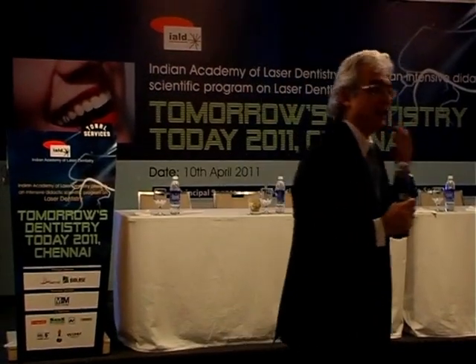And the same thing happens with a carious dentine. It absorbs the particular wavelength of the Diagnodent, and it emits it in a different wavelength, and then it beeps if there is a carious dentine. We know that there's 85% accuracy with the Diagnodent, with all the papers that have been published. Any other questions?